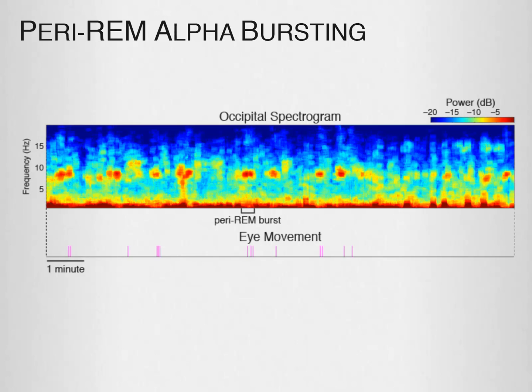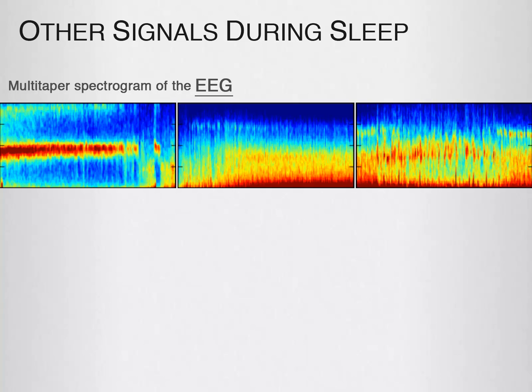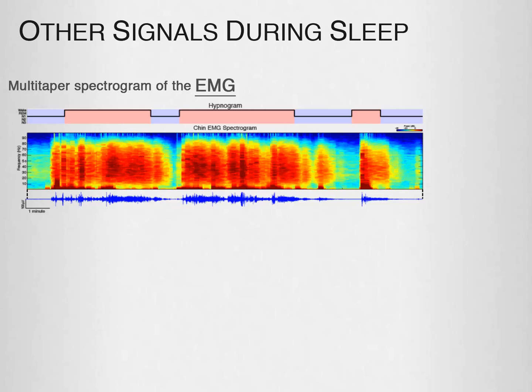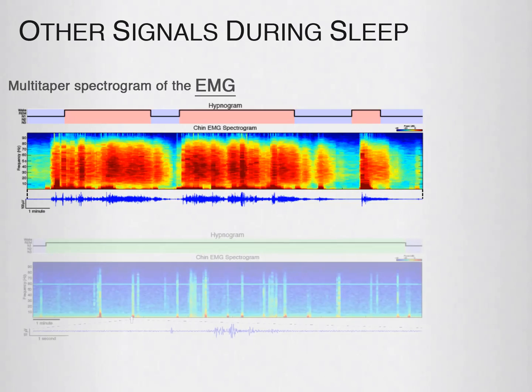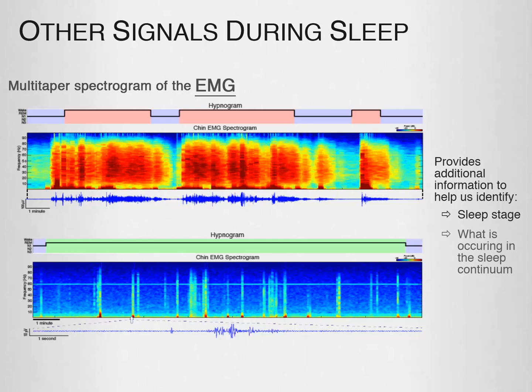Here's another example where we clearly see the distinct peri-REM alpha bursting pattern. Below the spectrogram, we are also showing data on eye movement during this time, highlighting the potential linkage between some of these peri-REM alpha bursts and phasic REM sleep during which eye movements occur. We can also use spectrograms of other signals to help with sleep analysis. For example, here's the chin EMG signal as a spectrogram. The chin is one of the first muscles to change tone as someone falls asleep. When awake, the EMG spectrogram shows very strong broadband activity. During REM, we only see little intermittent bursts of activity in the muscle. This data provides additional information to help identify what stage of sleep someone is in.